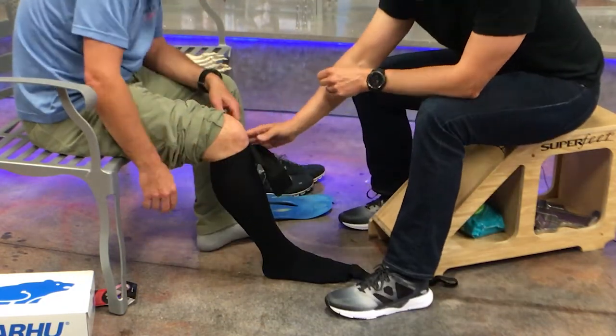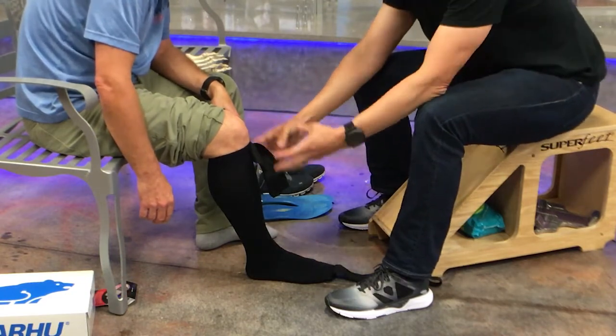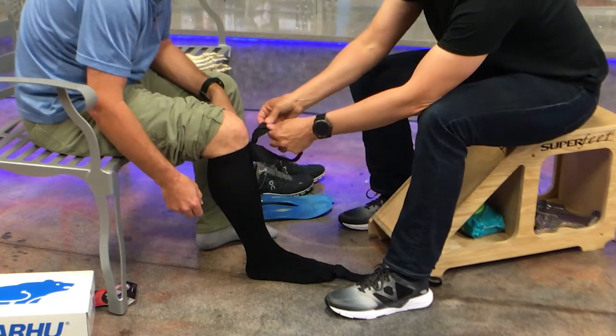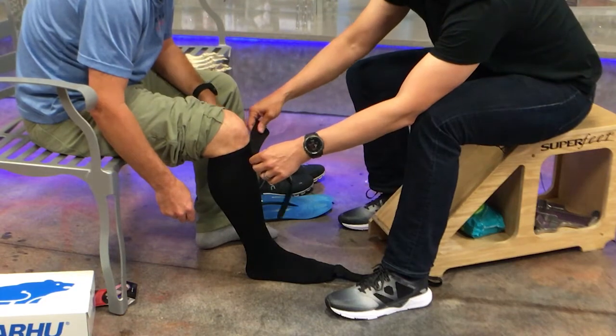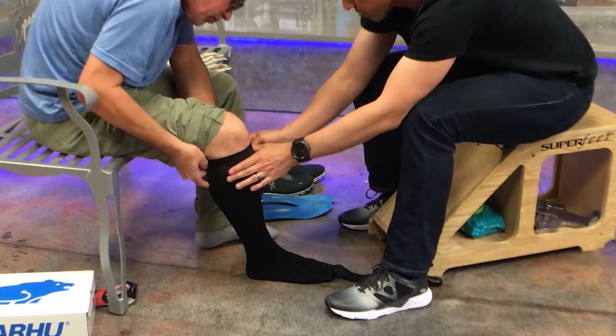You're going to find that that will actually happen more with people that are shorter and they have some extra material at the top there, so you want to pull that down. This upper strap is non-elastic and a lot of people think it's to hold the sock up. But its function is actually just to keep this ring centered at night while you sleep. So we'll put that in position here and just go ahead and fold that around the back.